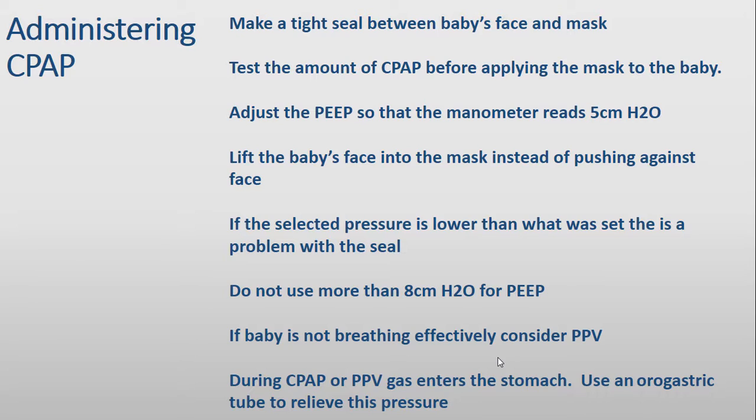And remember, during both CPAP and positive pressure ventilation, gas can enter the stomach. So we're going to need to use an orogastric tube to relieve this pressure. And I have a video at the end of this section that will show how to properly use that as well.